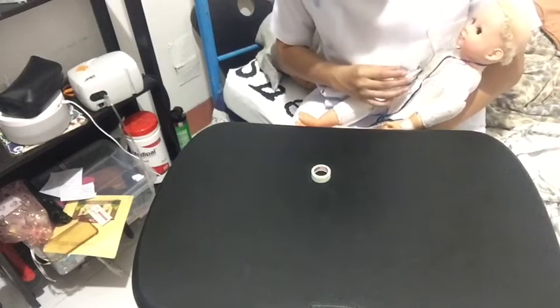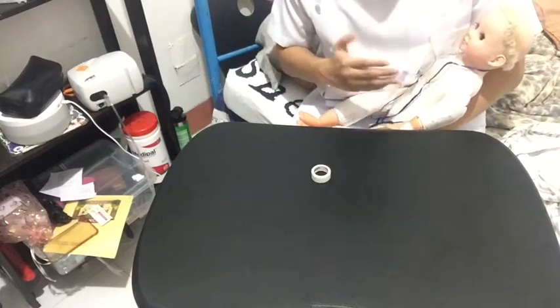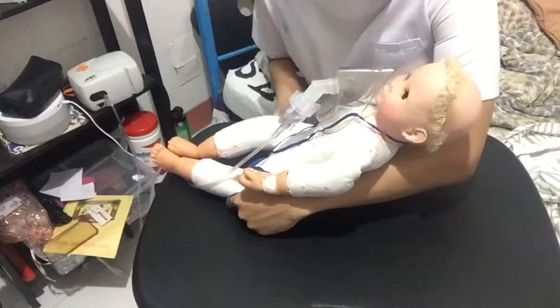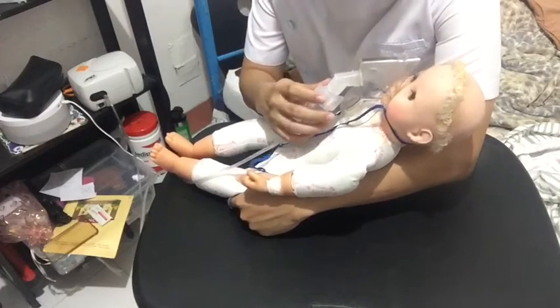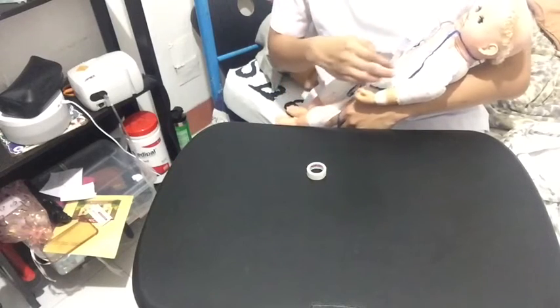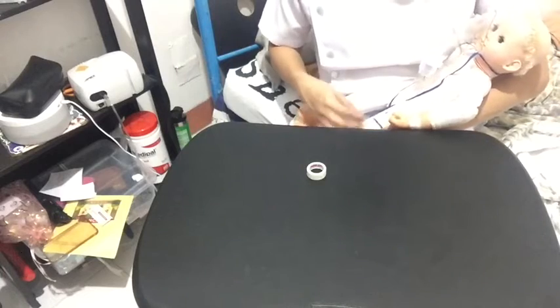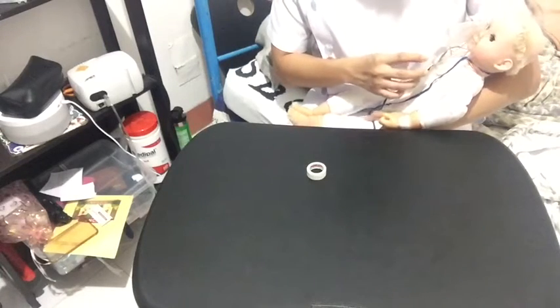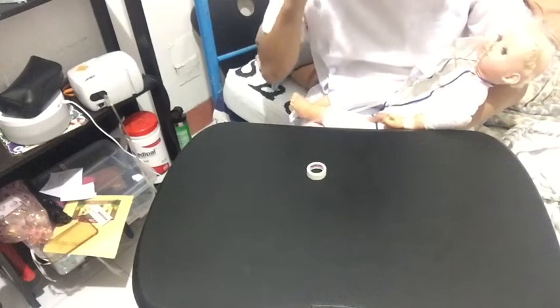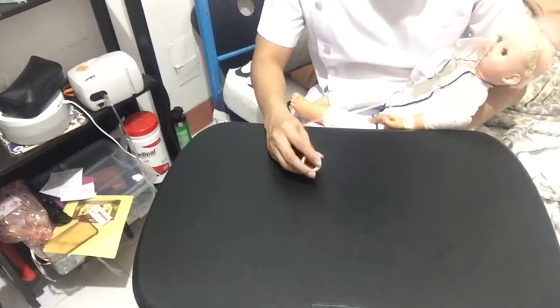to go down the cup. And from there, we're going to be monitoring the client's heart rate, especially during the procedure. And after doing this for a couple of minutes, as long as the doctor said, that's when we're going to start finishing the treatment.